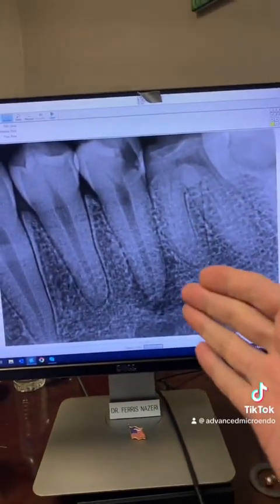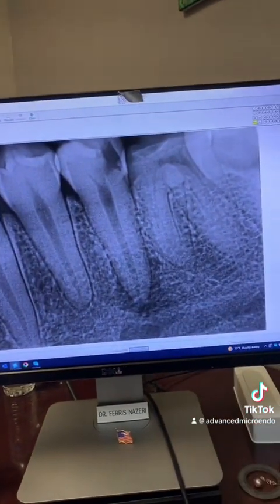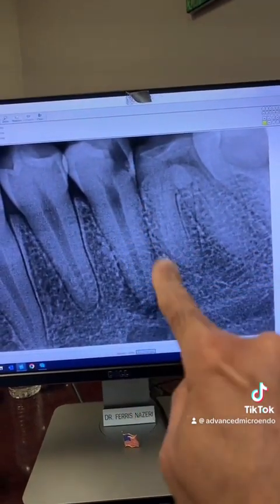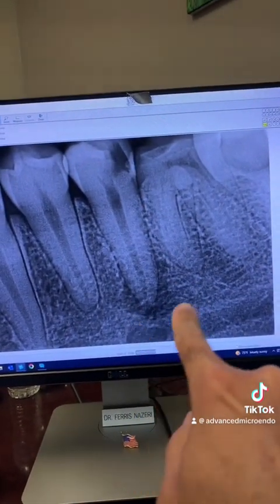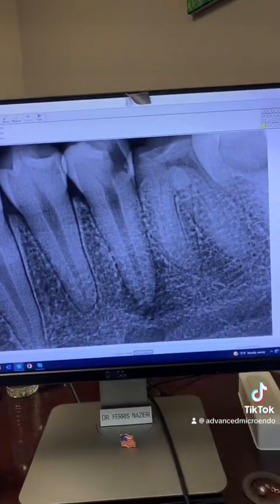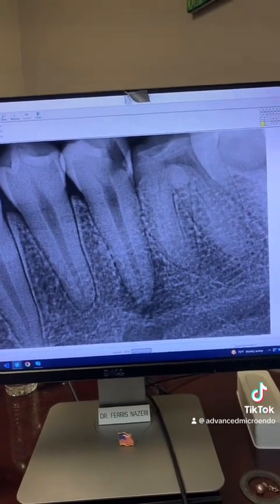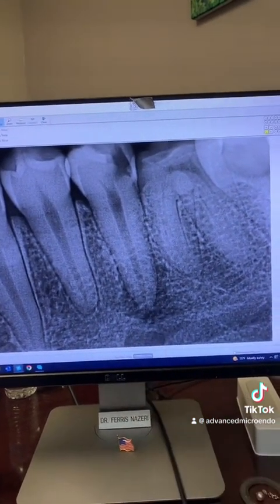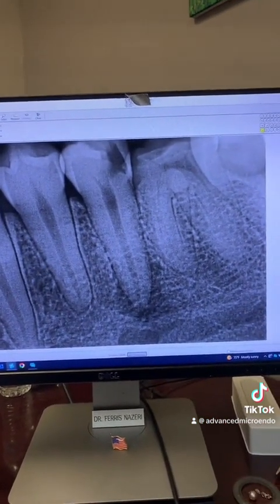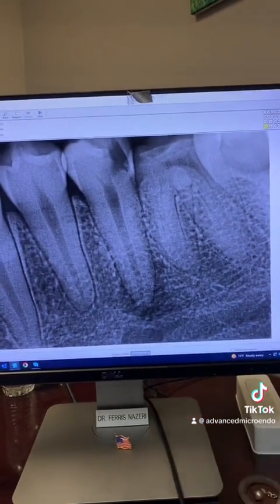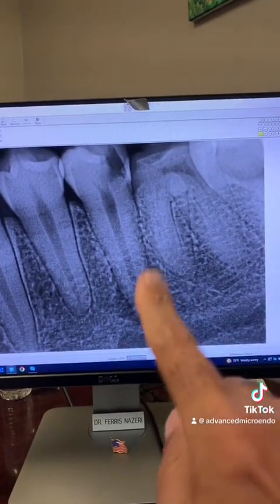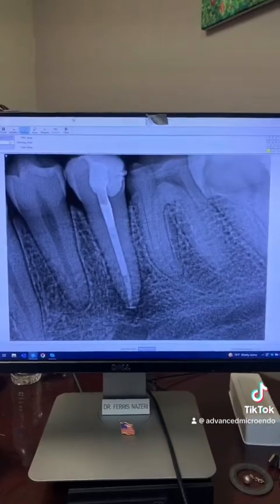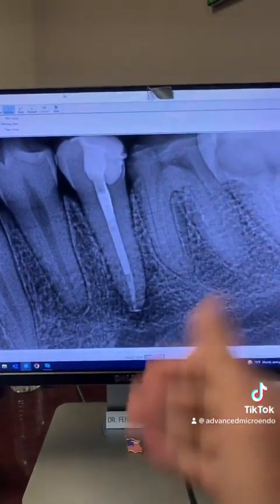This patient was referred to me for endodontic treatment of tooth number 20. As you can see, there is decay into the pulp, periapical radiolucency, and buccal swelling associated with the tooth. Be careful with the mental foramen right there and the mental nerve — you don't want to get sealer or gutta-percha anywhere near that area.